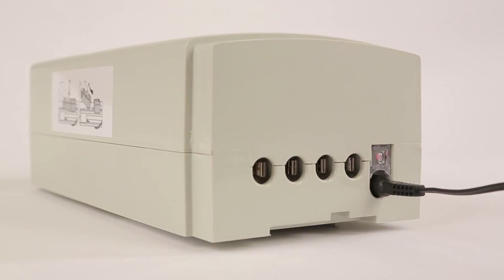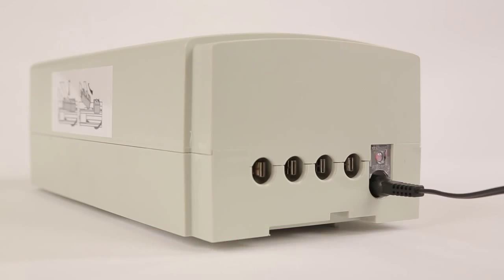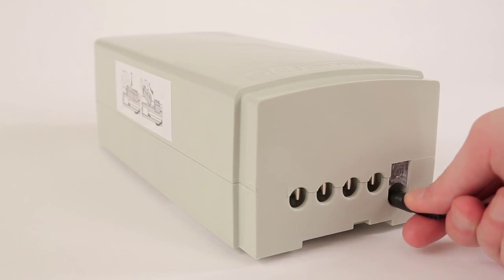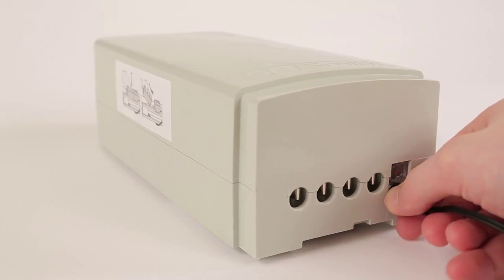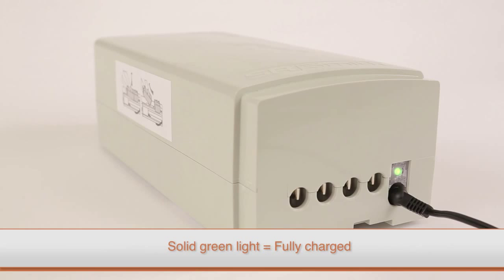To charge the battery pack, connect it to the charger. The indicator LED on the battery pack will illuminate red, indicating that the battery pack is charging. If the LED indicator on the battery pack is showing a flashing red LED when connected to the charger, the battery pack is not functioning properly and needs to be replaced. When the indicator LED is green on the battery pack, it is fully charged.